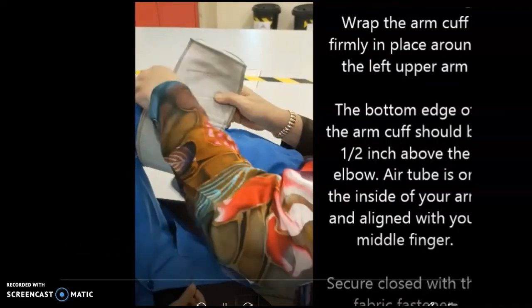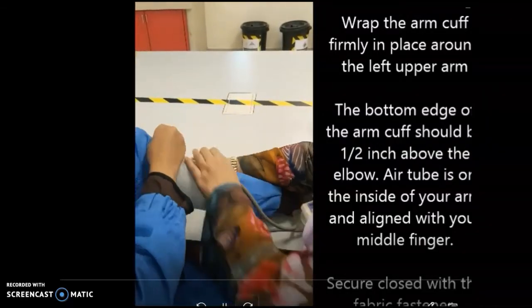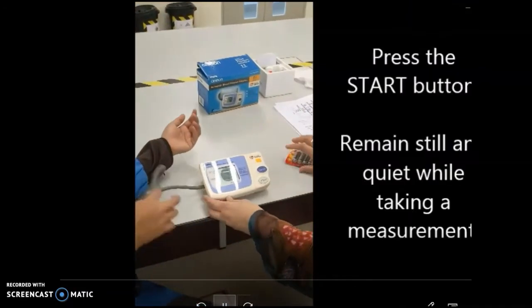Typically, this is how we set up the blood pressure sensor on the person to get the blood pressure.